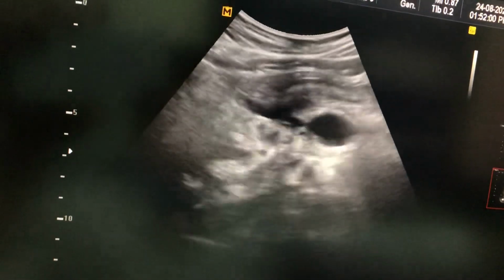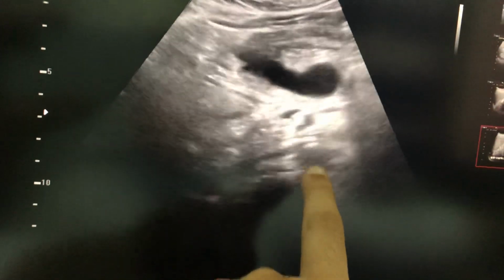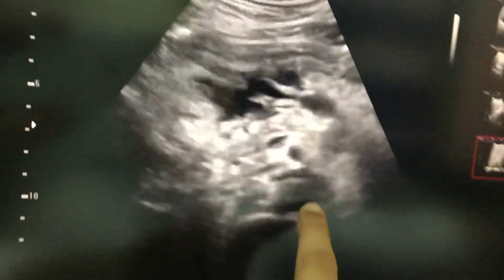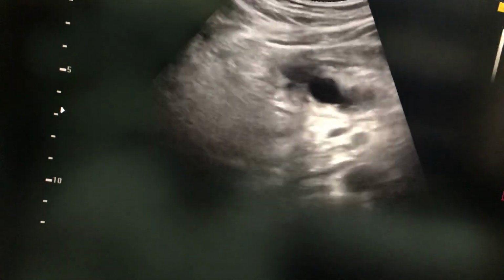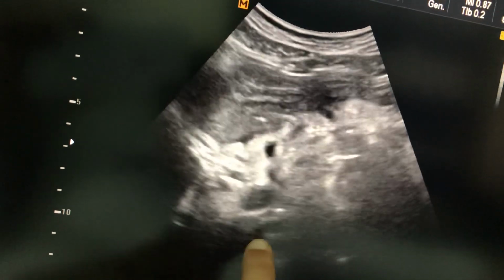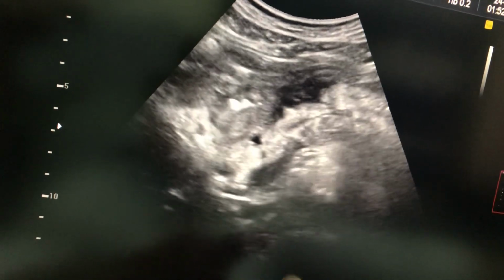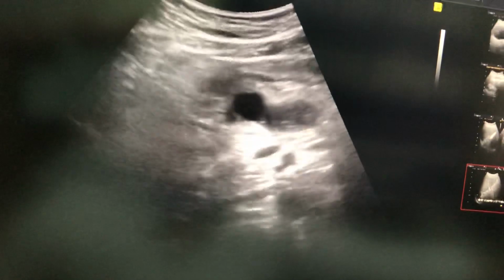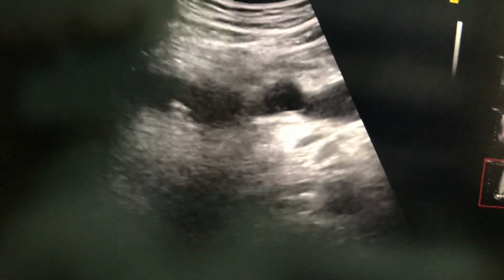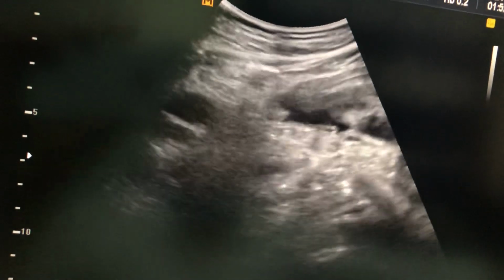That is not our concern regarding the aorta. It is retroperitoneal, behind the pancreas. And one more thing, this is the IVC over here. And this is the inferior mesenteric vein.